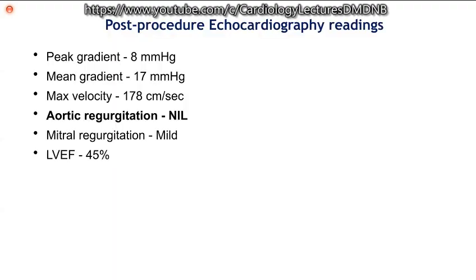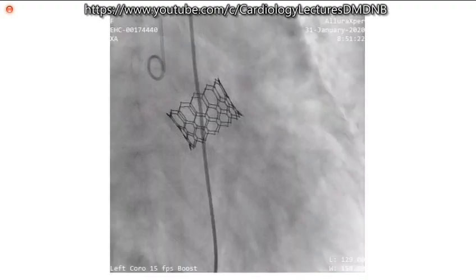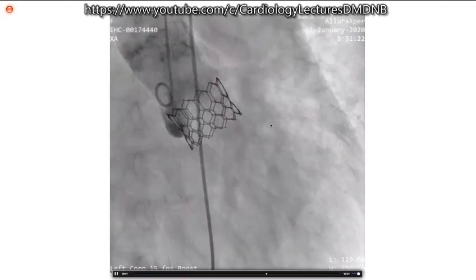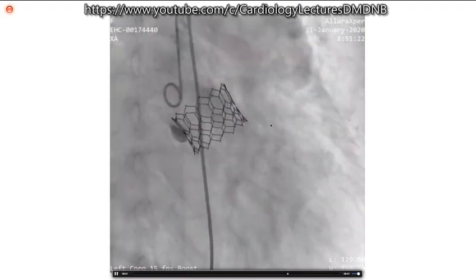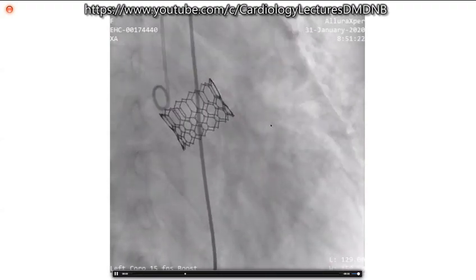I'm just going to pause that. I'm going to play this again. And you can see, compared to the aortic stenosis valve deployment, this valve is implanted a little deeper into the LVOT, and that is how the anchoring will happen. You start anchoring from the LVOT till the level of the annulus.